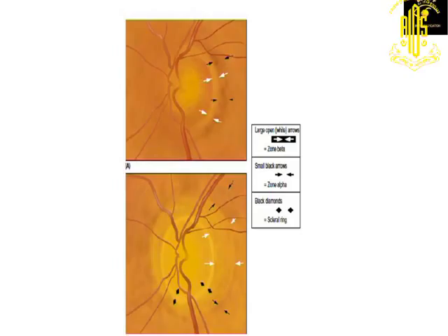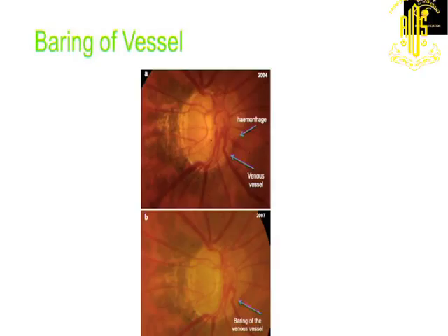These are the areas which show what we are interested in here, the beta zone of peripapillary atrophy, and you see that the beta zones are shown by these white arrows that you see out here. That's the beta zone. That's what we're interested in. A larger beta zone is actually a sign of developing glaucoma. So it's a pathognomonic sign that the patient would progress.